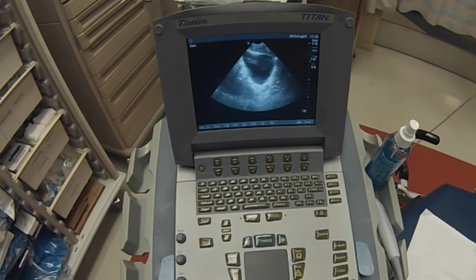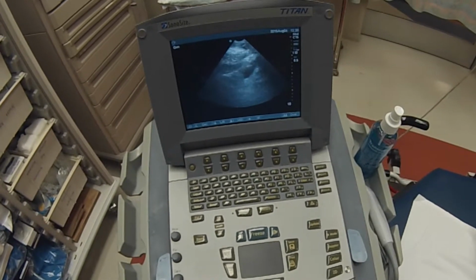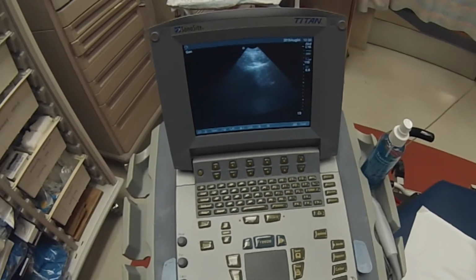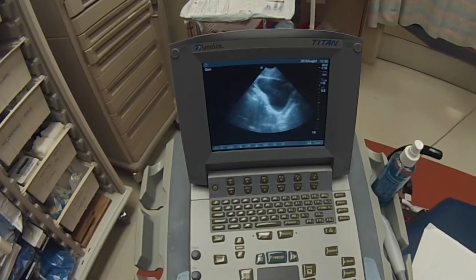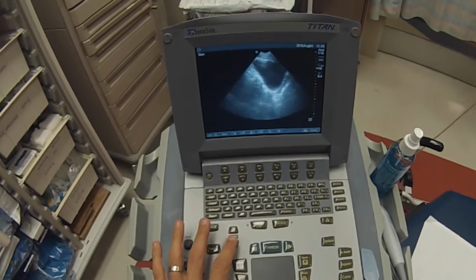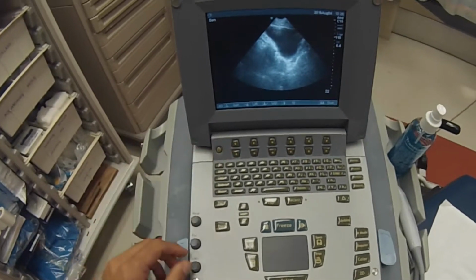And again, back to midline. And again, now I'm moving to the patient's right through the entire bladder. Again, we get some pelvic vasculature. And then your iliac crest. So make sure during the pelvis, you've done two things. The first, since we've actually recorded this a couple of times now, we've actually already fixed the gain.